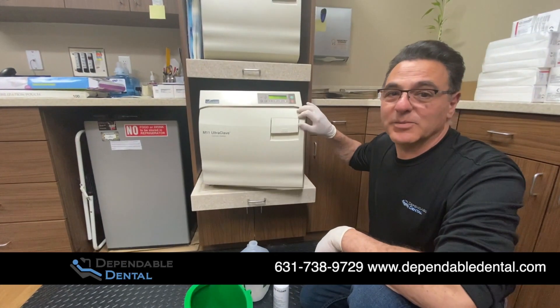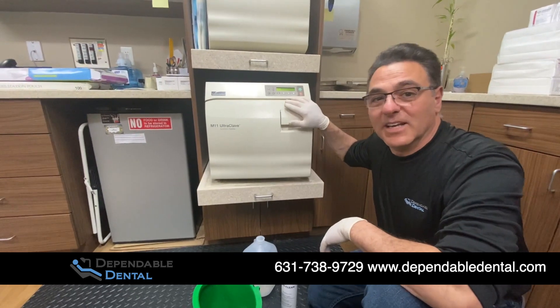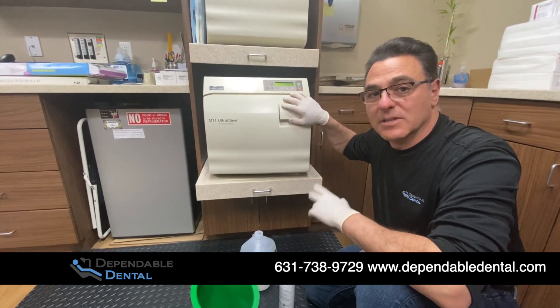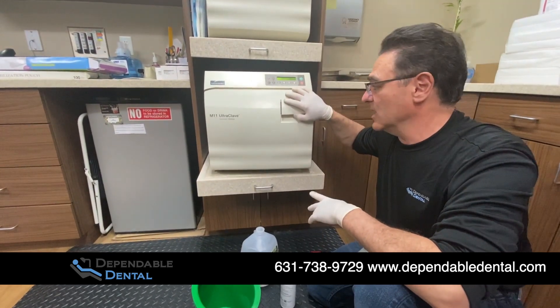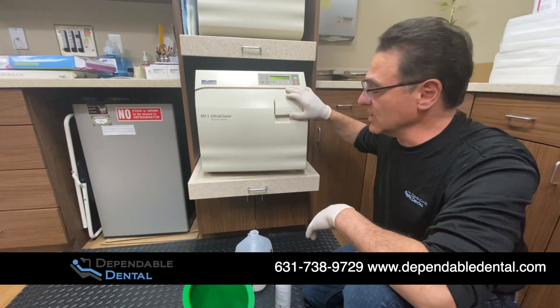Hi everybody, this is Al Monteleone from Dependable Dental. Today we're going to be showing how to do a cleaning on a Midmark M11. This will translate to other units — the Midmark M9, and other competitors' units, the Tutanauer, and some other units out in the field also.